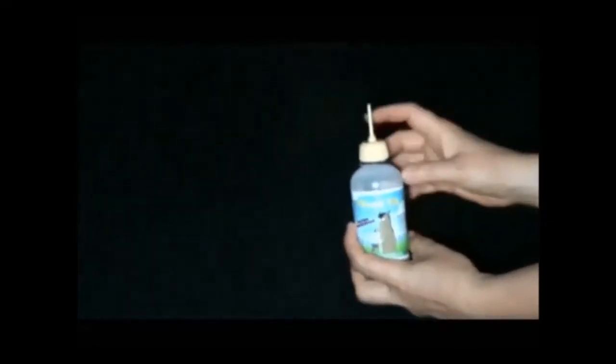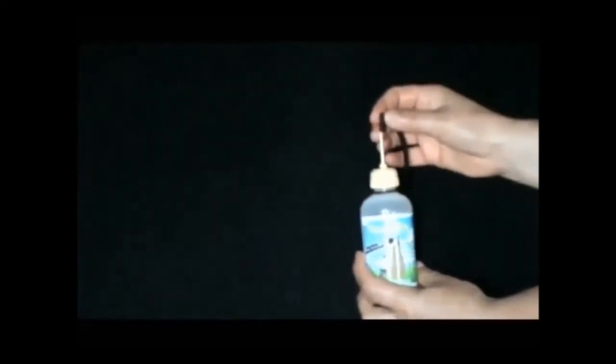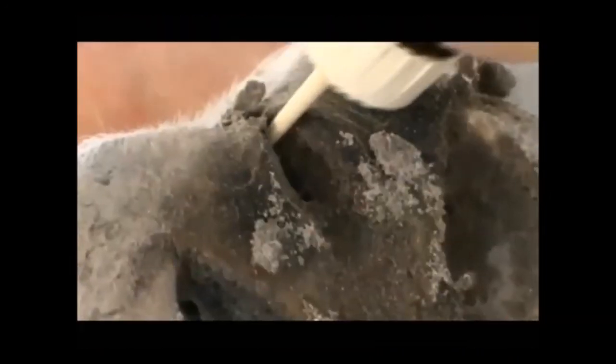It's flexible so you can reach into difficult places, and it won't break off in the hoof. It comes with a refillable bottle and has an attached closure cap that won't get lost. It's ideal for liquid homeopathic remedies too.